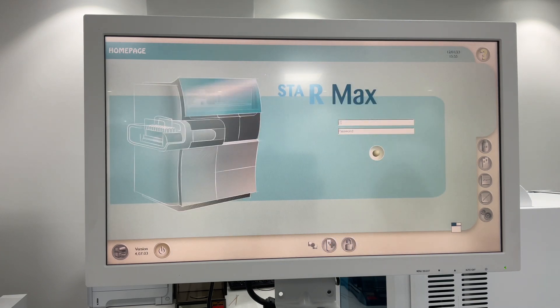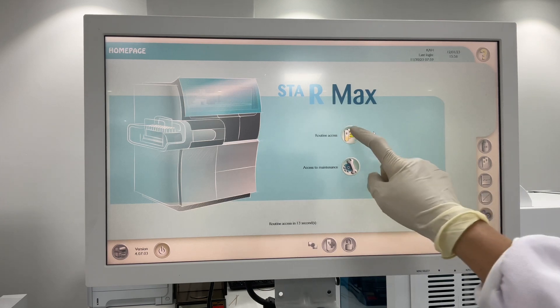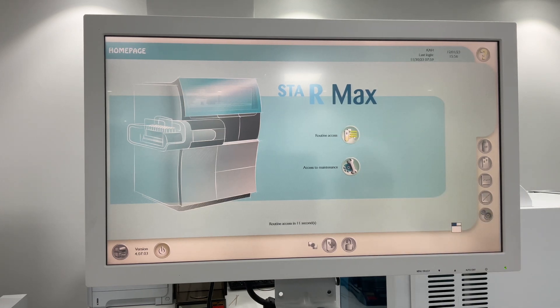Enter your username and password, then Enter. Click on Routine Access to quickly access the main menu.